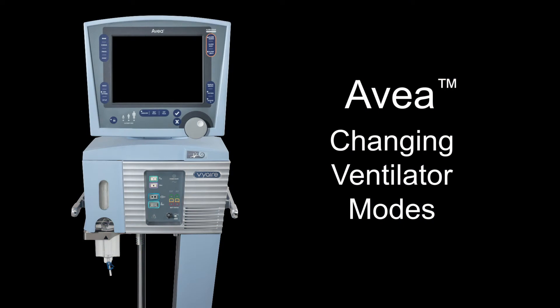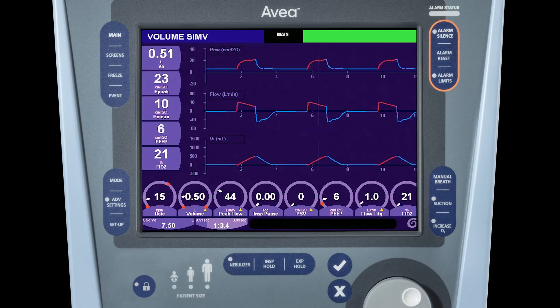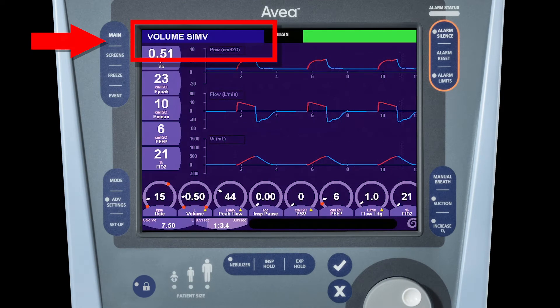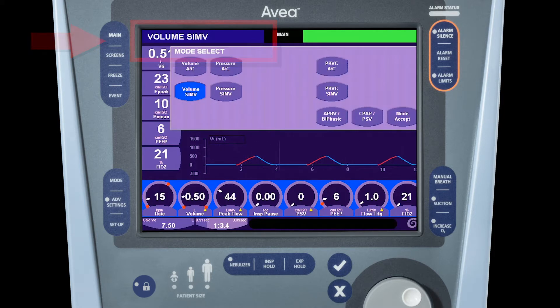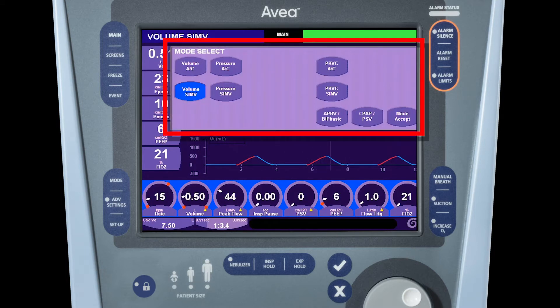We will now review how to change the mode on the Avia ventilator. To open the modes window, press the modes banner at the top left of the screen to open the mode select window. All of the modes for the selected patient size will be displayed in this window.